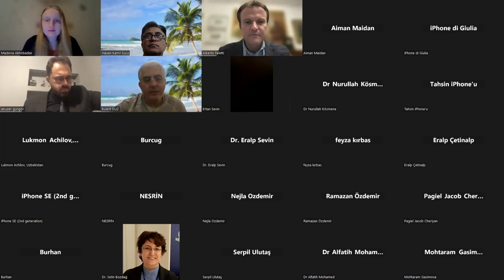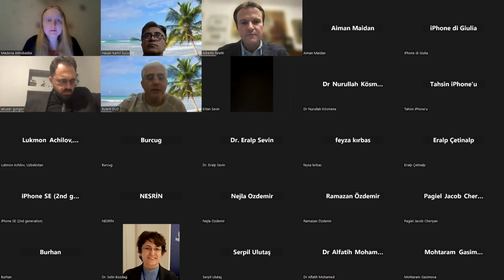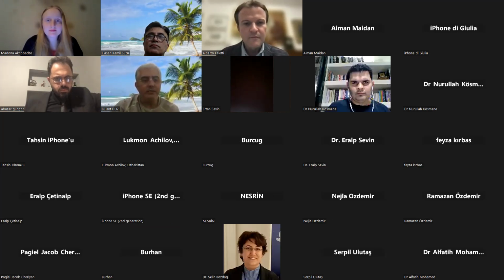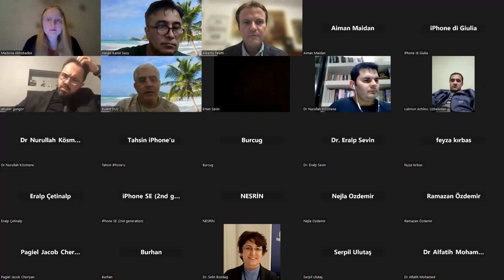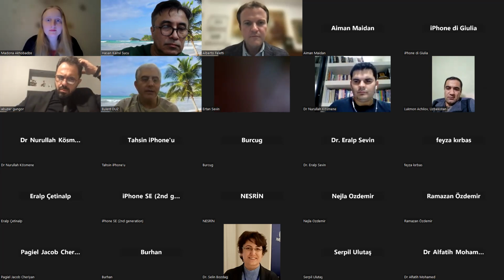I'm very glad to hear you because your experience is extremely valuable for endoscopic neurosurgery. It's really an advancement for us. Actually, I have similar experience to you, because I have more than 300 patients operated with endoscope, but I have been using the ventricular port technique for the last 18 years.